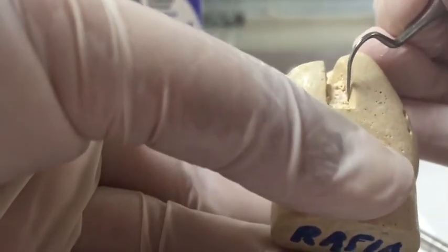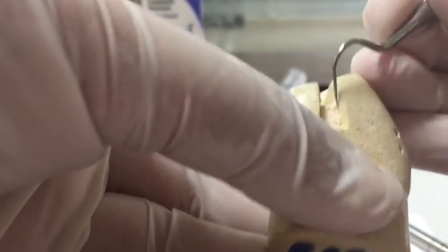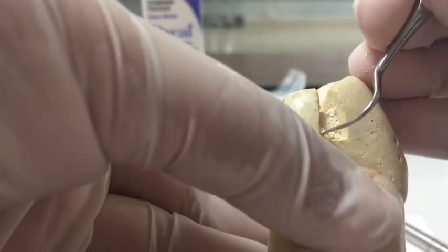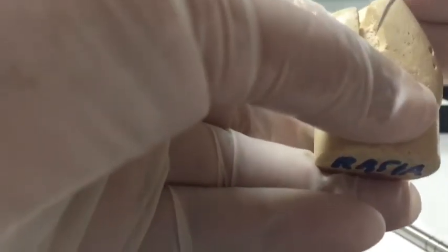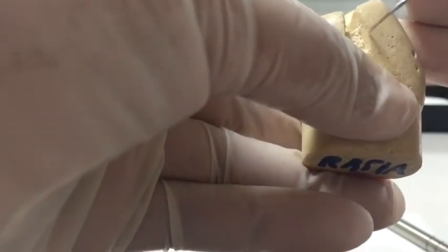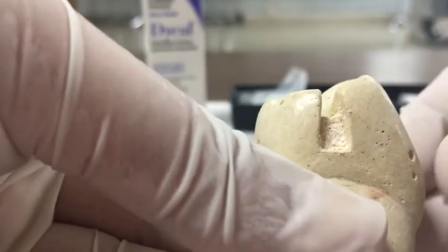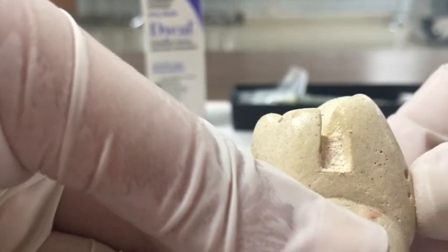Now we will use a probe to remove the excess cement applied on the walls other than the axial wall. Now we have a calcium hydroxide lining placed in our proximal box for class 2 cavity preparation.